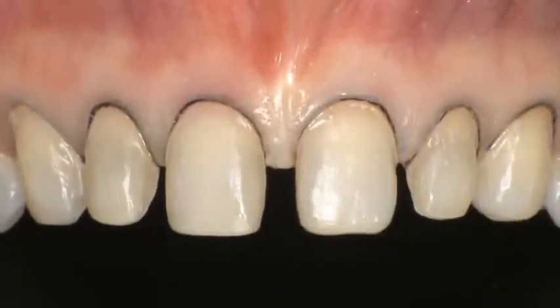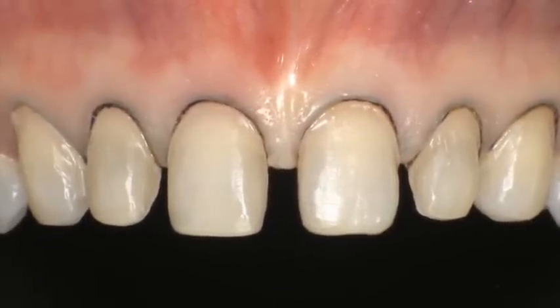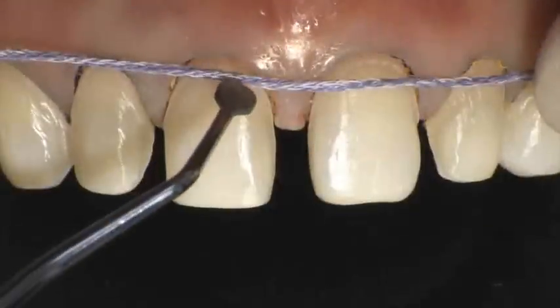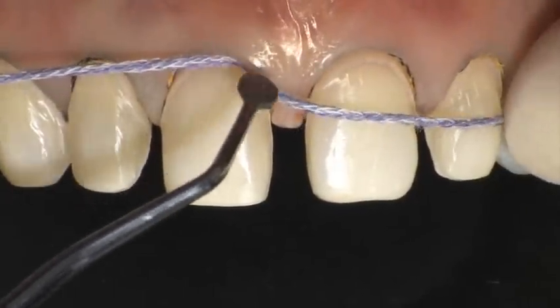A second cord, bigger compared to the first, will give the opportunity to open the sulcus and put in evidence the zone beyond the preparation.